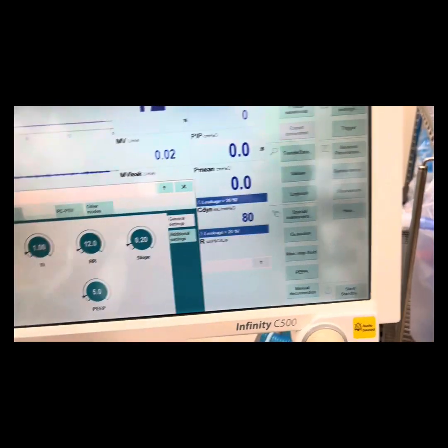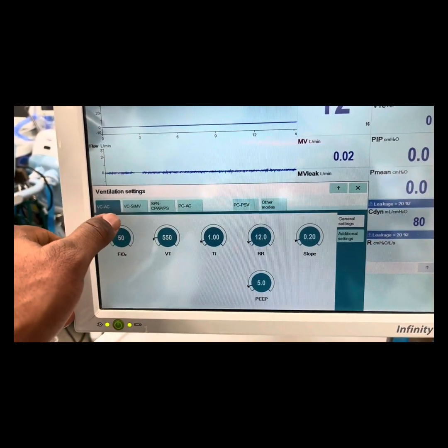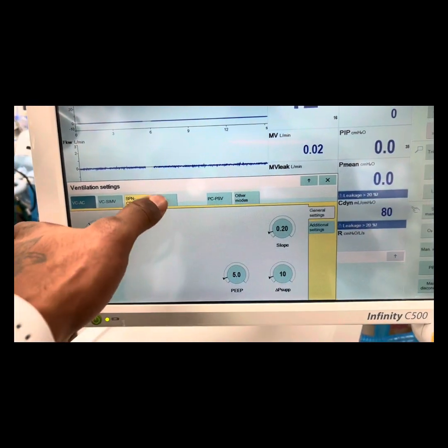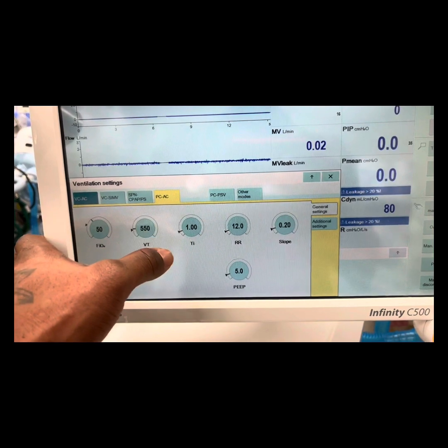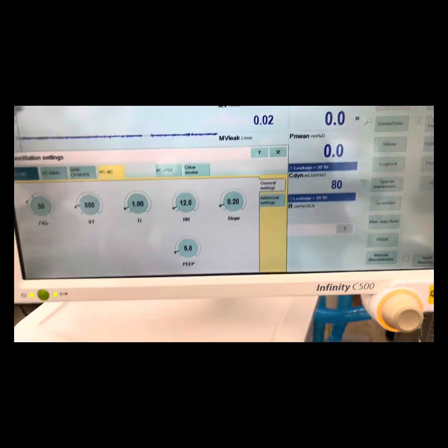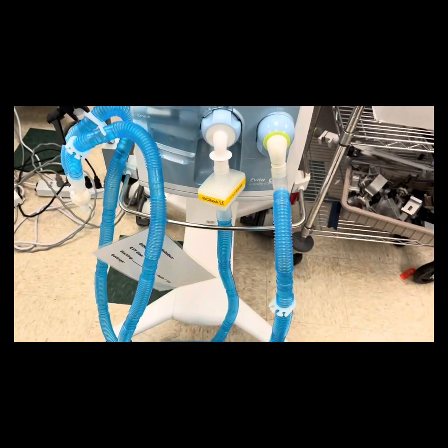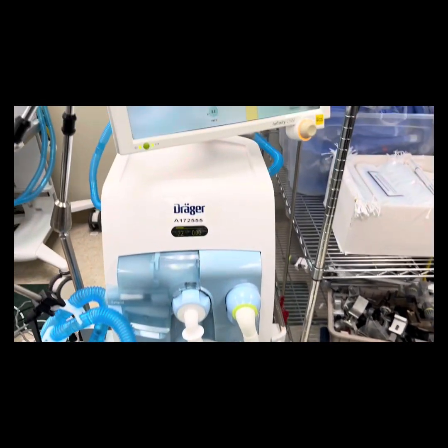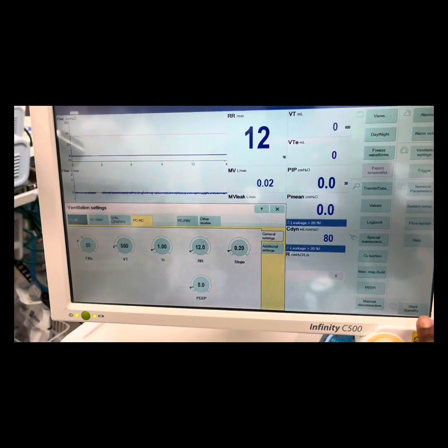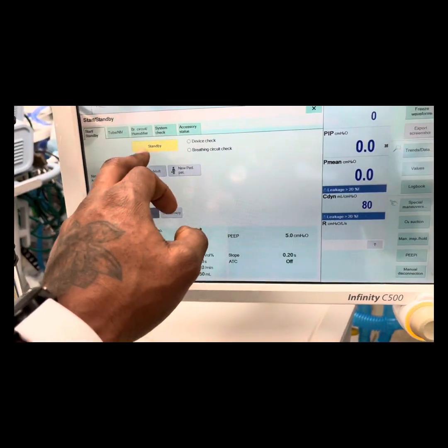This is pretty cool — one layer that we use. Volume control, assist control, SIMV, pressure support CPAP, pressure control AC. Stand by.